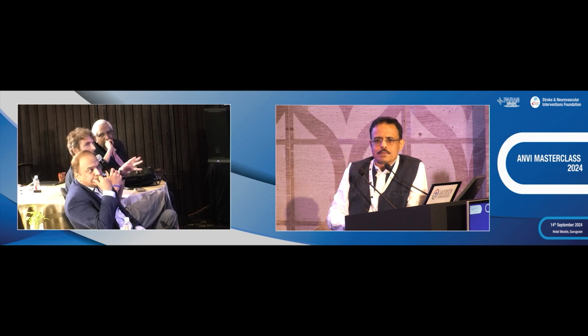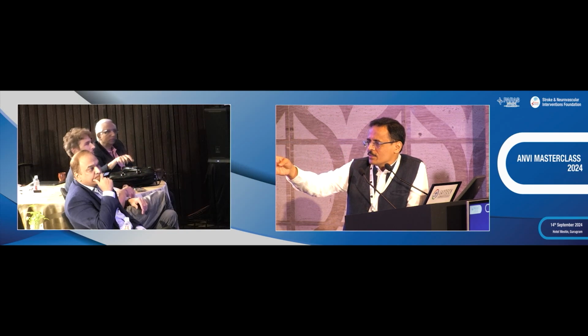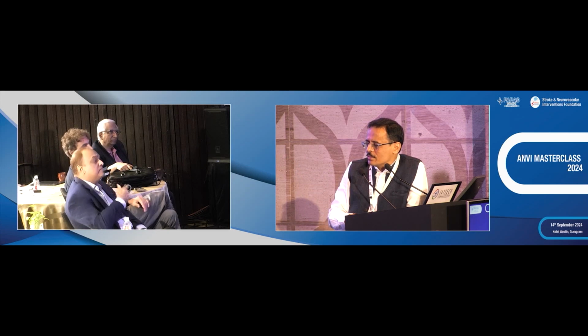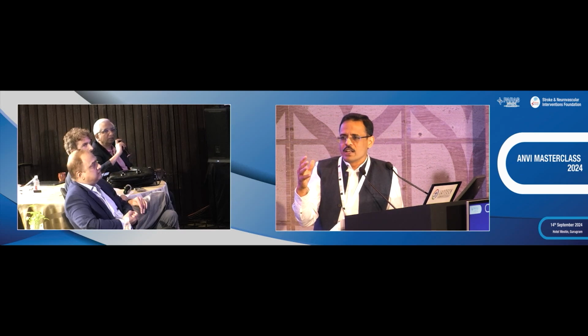For me, M1 is coronary stenting. Coronary stenting. Yeah. So balloon mounted from my side. For me it's coronary stenting because I had occlusions with Credo. Arvind? Coronary. Yes, our guiding was right there. So maybe again, coronary, because we landed in trouble even after stent placement, which wasn't acceptable.